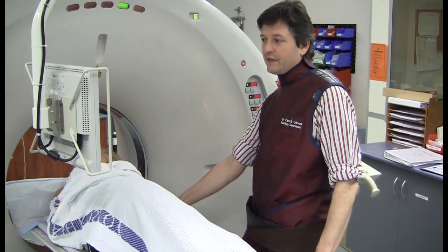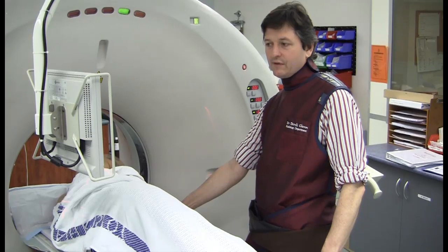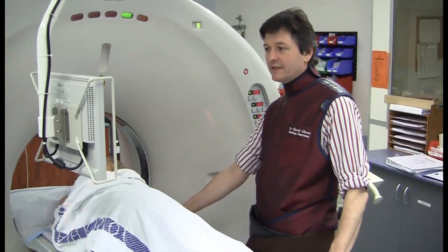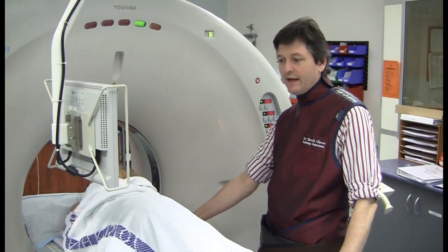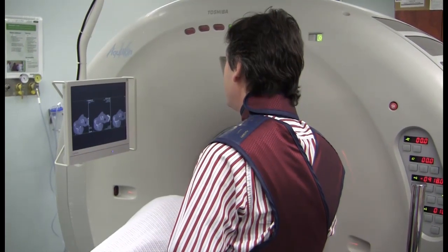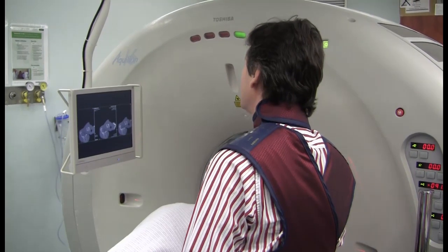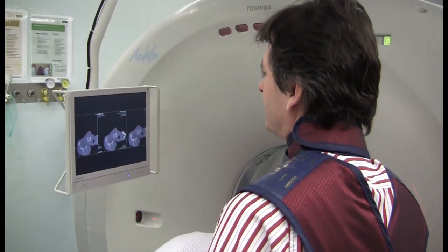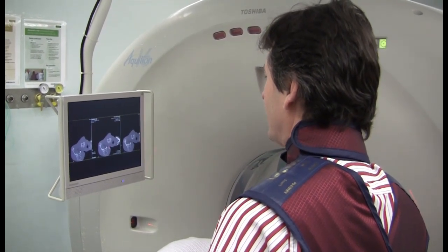To find the relevant intervertebral parameters, we use fluoroCT — basically scanning up and down. Once we've lined up at the right spot, we're going to use a 25-gauge spinal needle. We'll do one millimetre slice thickness, and take the mA down from 20mA to 10mA. We're running at 120kV, 10mA, and right now we're slicing through.